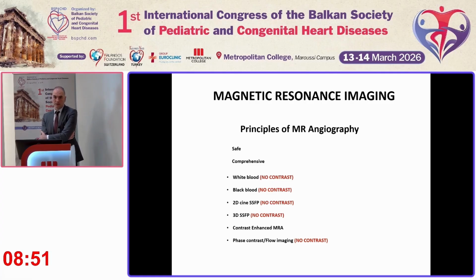A lot, if not the majority of the sequences, do not require the use of contrast. Let's think of some scenarios, some patients with renal failure, patients with contrast allergies. They could efficiently have an MRI exam that could inform accurately without the use of radiation or a contrast agent.